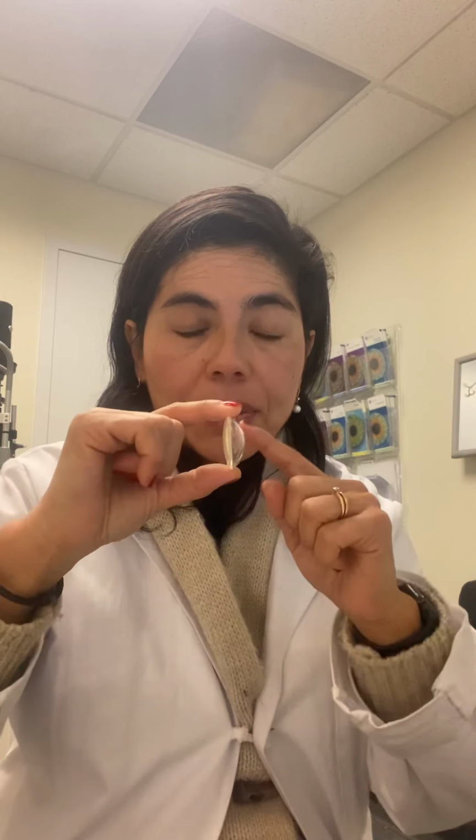The cataract is like a pillow in a pillowcase, and the center part of the pillow is what gets the opacity. Sometimes the actual pillowcase or capsule, the anterior capsule and the posterior capsule, can get opacified as well. And so we try to take care of cataracts as quickly as we can when patients are symptomatic. Usually the vision is worse than 20/40 with your best glasses or glare test. If you can't do what you need to do, we recommend doing it sooner rather than later. So we take out this pillow and take out the front part of the pillowcase, and there's two ways.